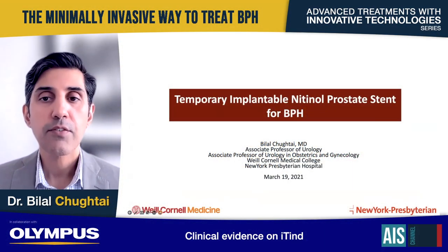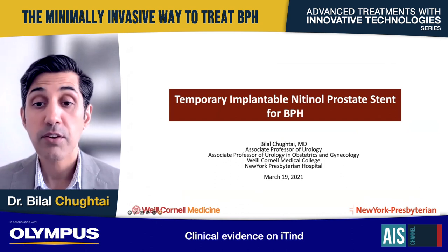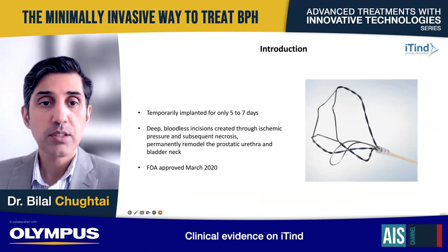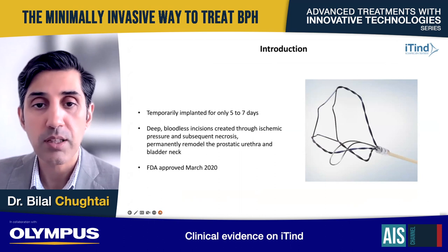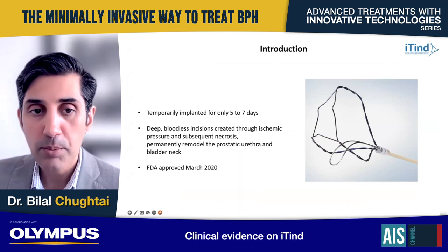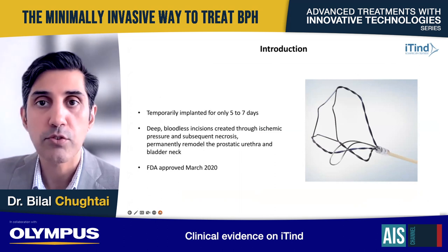Good morning, and thank you for the opportunity to present on iTind for BPH, specifically focusing on clinical data. As we've already discussed, iTind is a temporary implant for 5 to 7 days, creating deep bloodless incisions through ischemic pressure and necrosis, which permanently remodels the prostatic urethra and bladder neck. It was FDA approved in March of 2020.